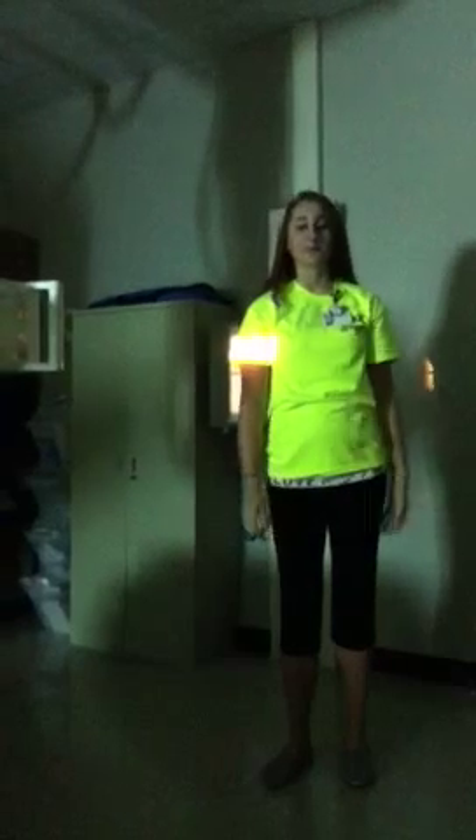My name is Chelsea and today we'll be doing a PHS X-ray. Before I go get my patient, I want to set up my tube.